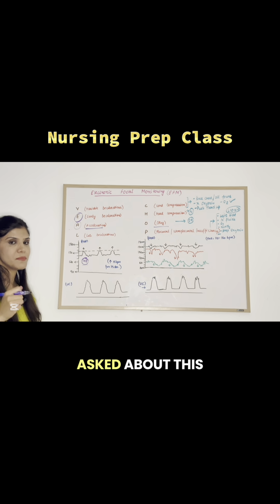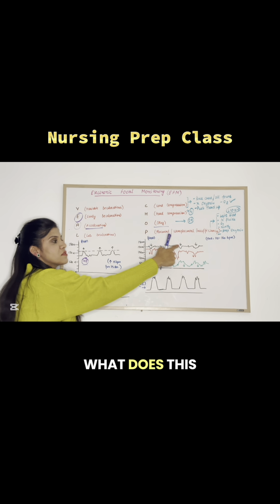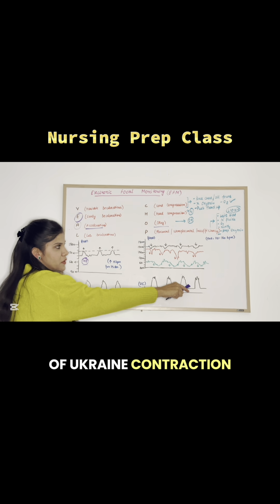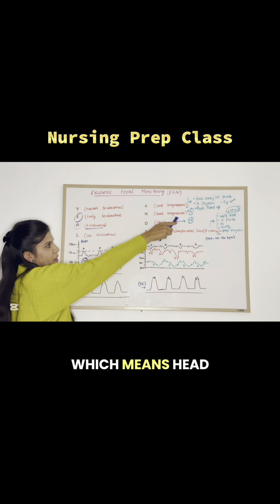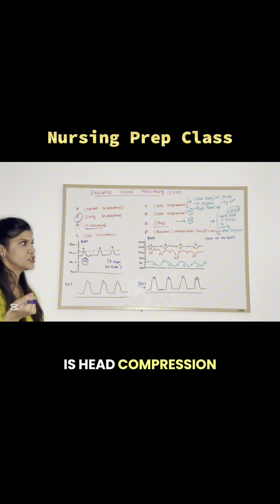You will be asked about this in NCLEX, that what was the reason behind this graph? What does this graph show? So this graph represents, which is a mirror image of uterine contraction. It represents early decelerations. And in front of early decelerations, we have H, which means head compression. So the reason for early decelerations is head compression.